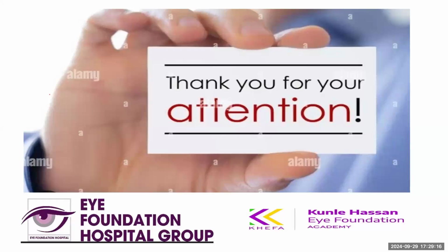The density, we said, is a measure put in the machine to quantify the perfused area compared to the whole area imaged. Meaning if it images an area, let's say one disc diameter, and half of the disc diameter is unperfused, it will give you a vessel density that aligns with that.